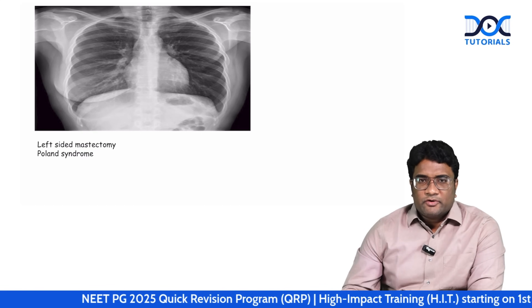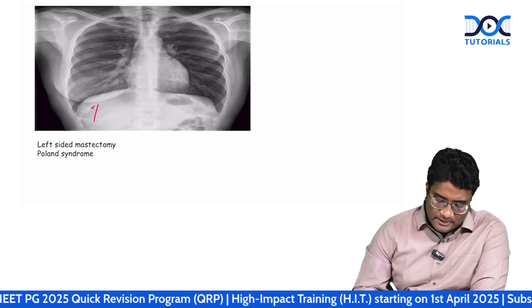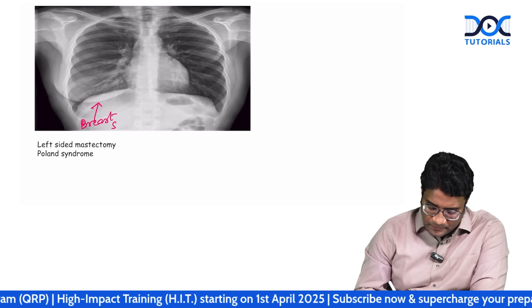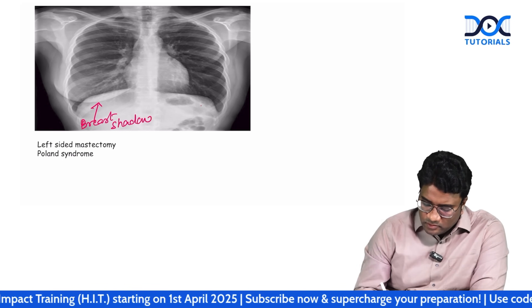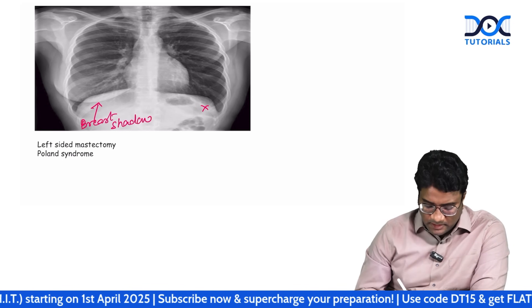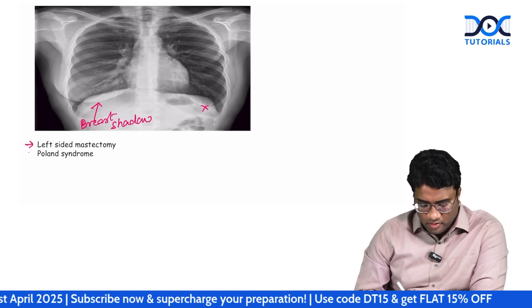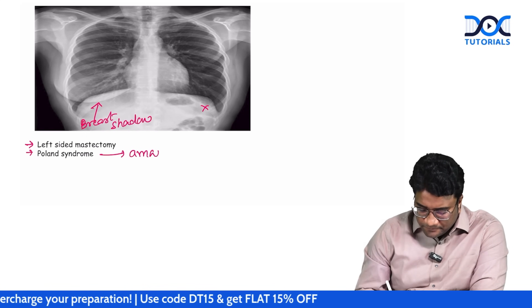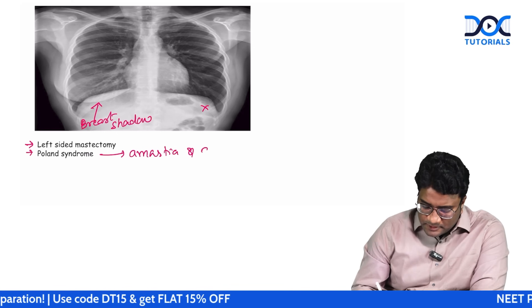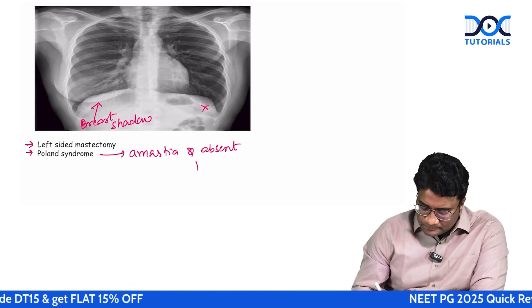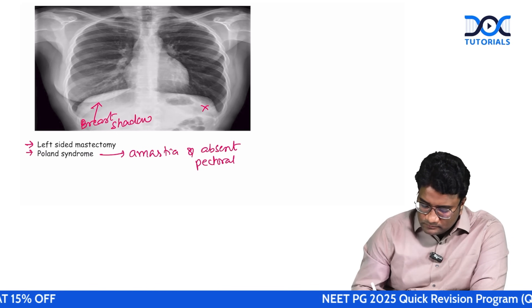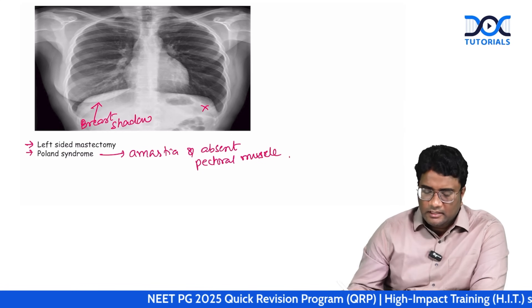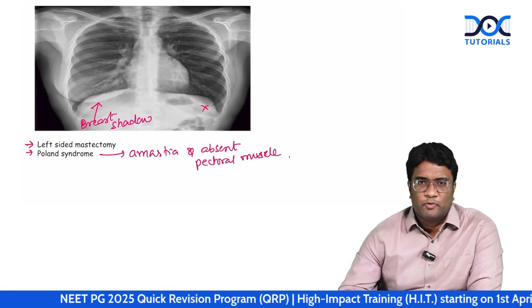In this chest radiograph, you can see the breast shadow on the right side but not on the left side. This must be a left-sided mastectomy or Poland syndrome. Poland syndrome is amastia with absent pectoral muscles.